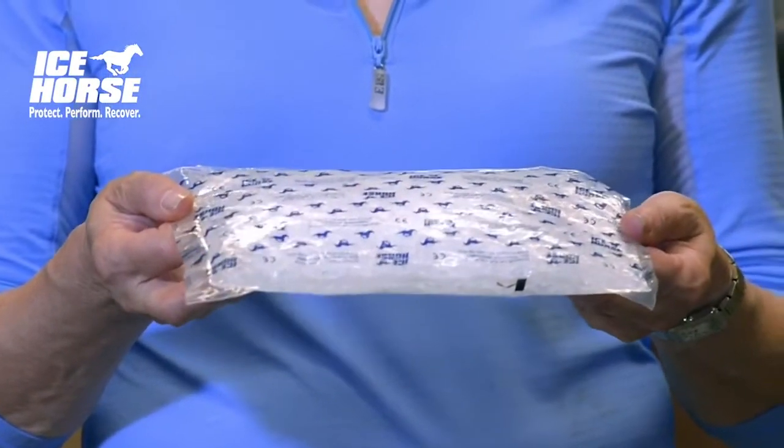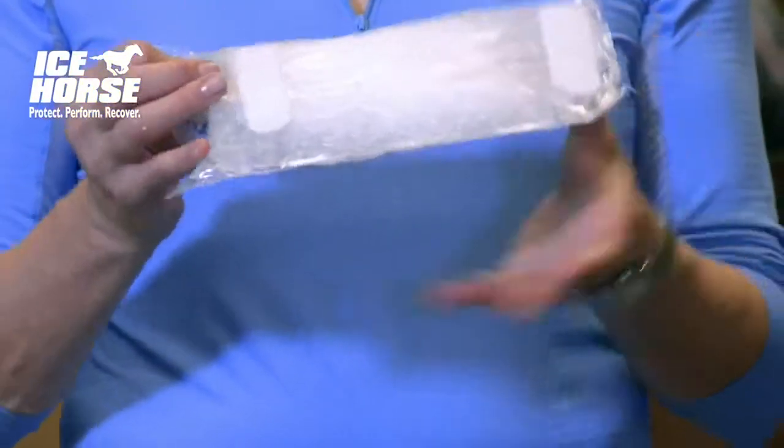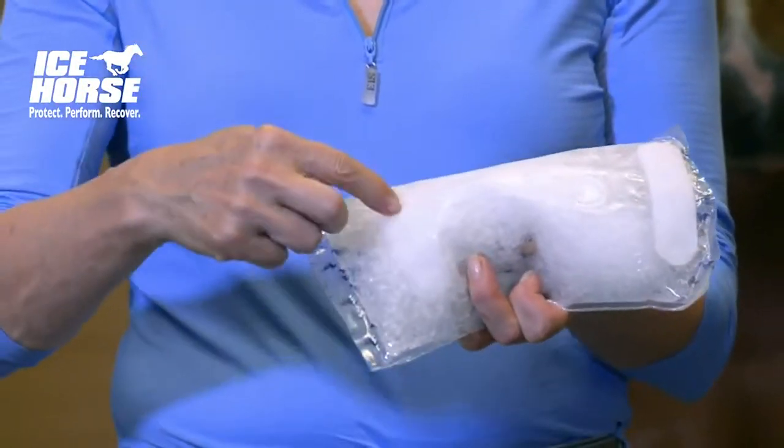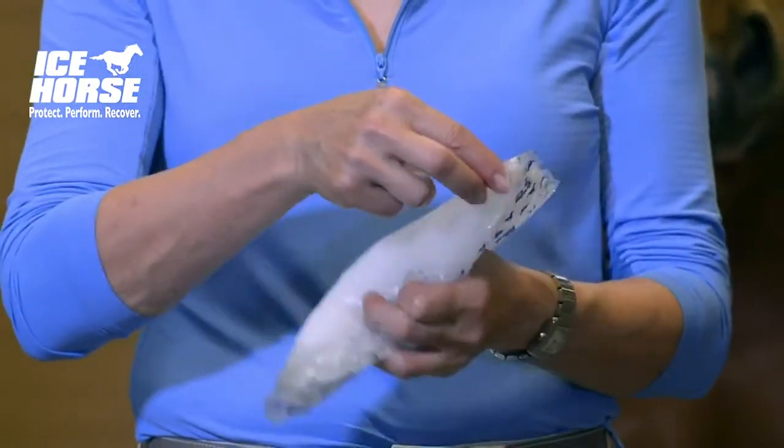When you remove your ice from the freezer it will look like this. Flip the packs over and remove the covers from the velcro strips so that it will stick properly to the landing pads.